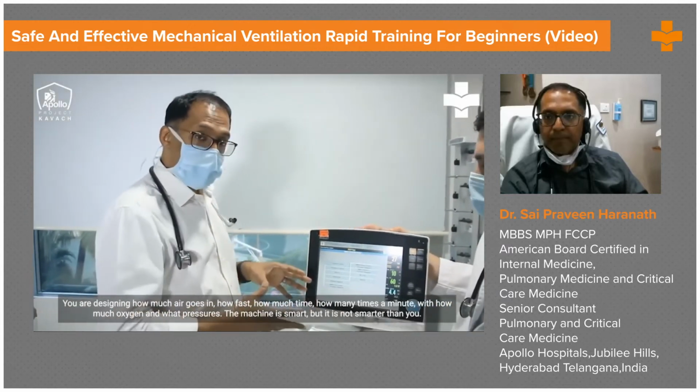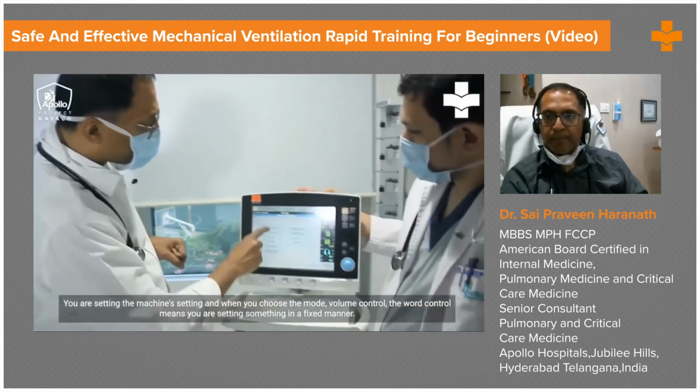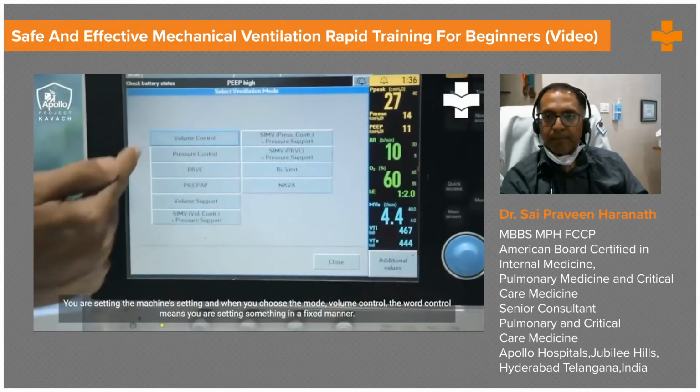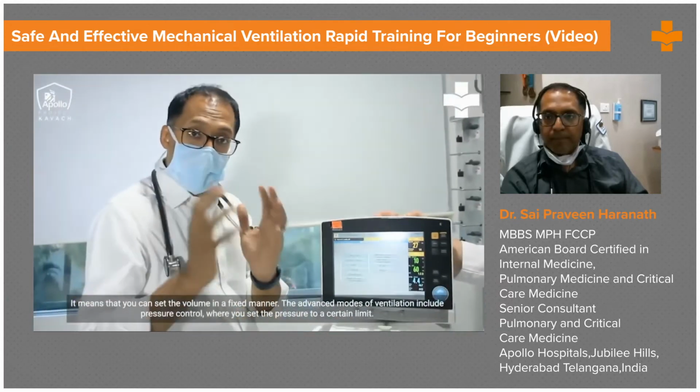So the machine is smart, but it's not smarter than you. You are setting the machine settings. And when you choose the mode, in volume control, the word control means you're setting something in a fixed manner. So you can set the volume in a fixed manner.